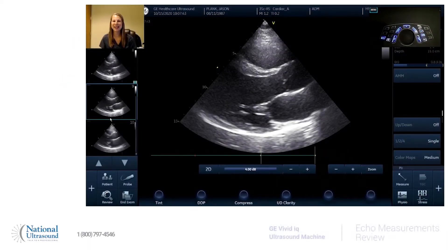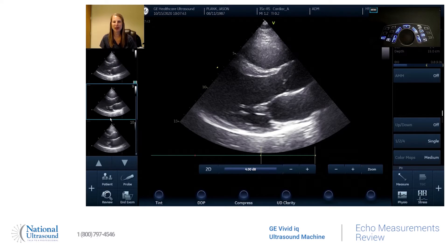Hi, my name is Jackie Klevik. I've been a registered cardiac, vascular, and general sonographer for eight years. I am at National Ultrasound working on a GE Vivid IQ, and today I'm going to show you how to measure.